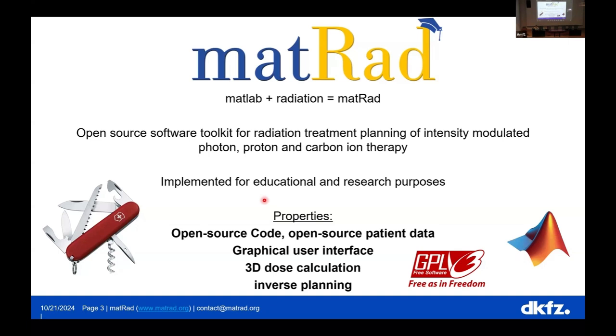So today we do all of this with computers, and so you need a lot of knowledge and code to basically implement a simulation of dose. We heard about different dose calculation algorithms and so on. And that's kind of the primary functionality. We want to provide these tools, these codes for open research, so that students can also look into it and learn how dose calculation works, for example.